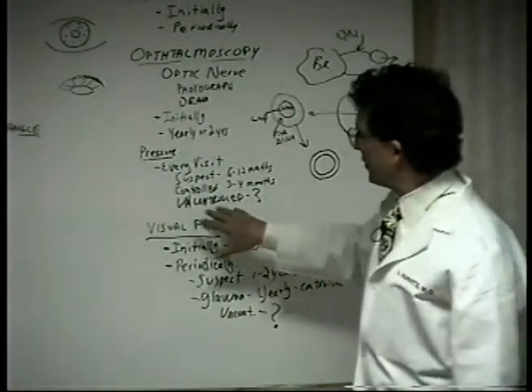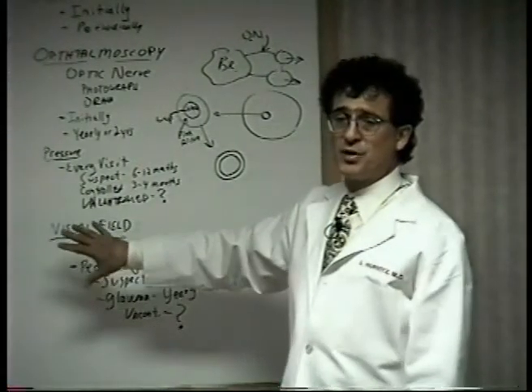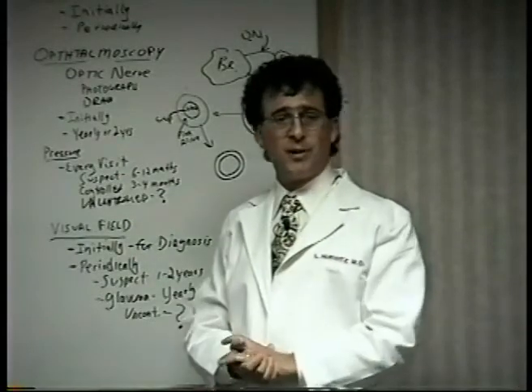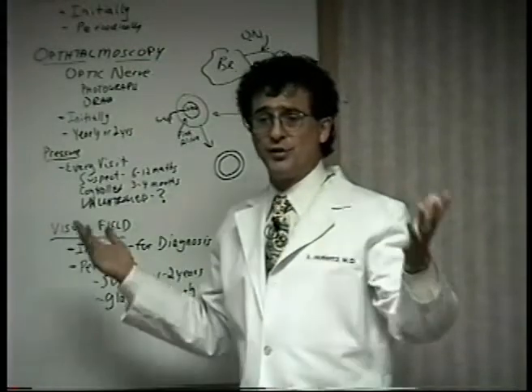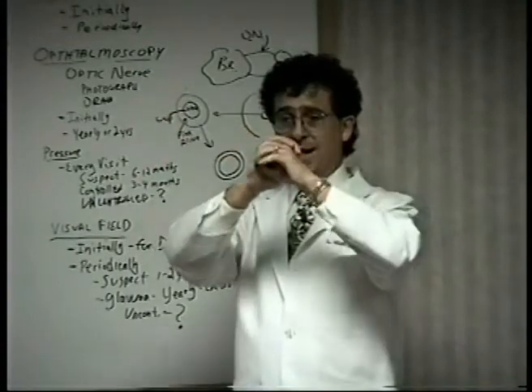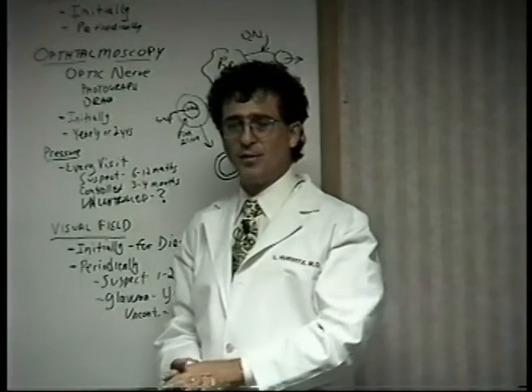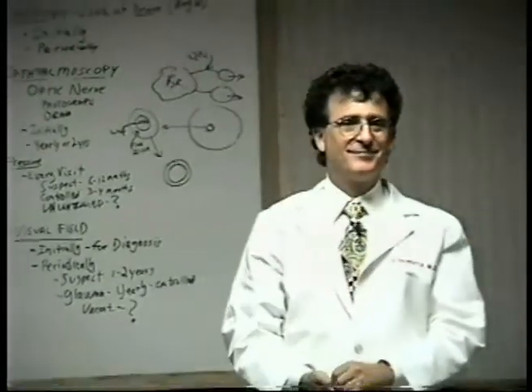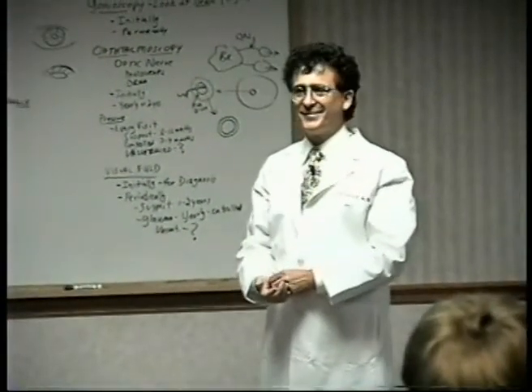So macular degeneration does enter into this. If it affects your vision and bothers people's vision, it affects the field. Everything shows up on the field. Any real visual problems people have will show up on that field, but it might not look like glaucoma. It would look like macular degeneration looks on the field, which is just the opposite of that one with the tunnel vision. It would be black in the middle and open and white on the outside. Okay. Any other questions? Okay. Well, very good.